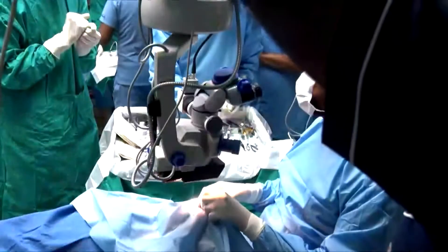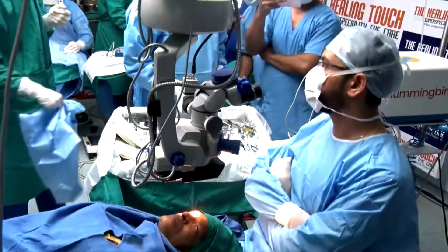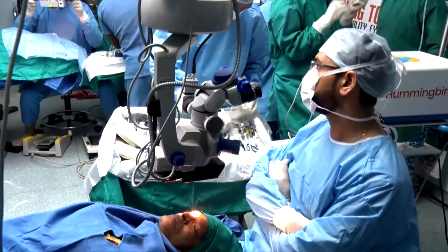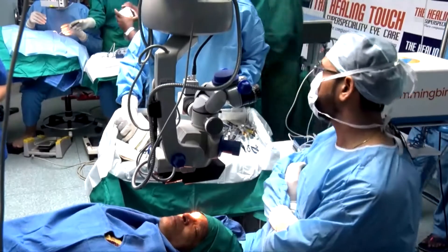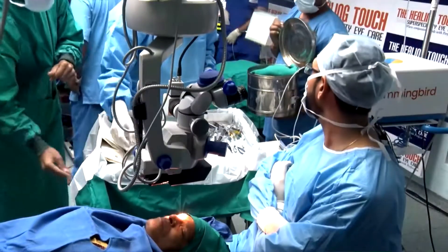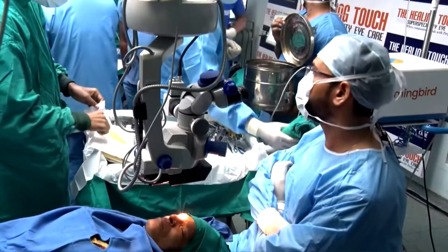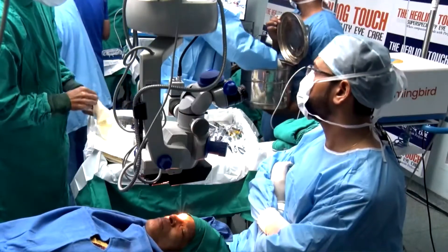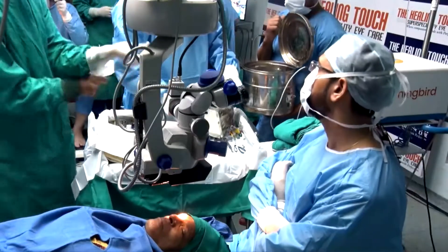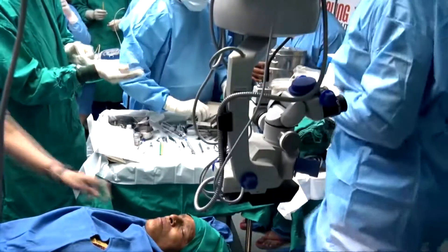With mono-haptic lenses you have to wait a couple of seconds to fix them, and there are chances of rotation. You have to leave them at three to five degrees under-shot, and after removal of the speculum you do the final alignment. With this double-haptic lens, you just leave it at the desired axis and remove the speculum. I've hardly seen any rotation due to the double haptic. Thank you, Dr. Lalit — it was a wonderful surgery.